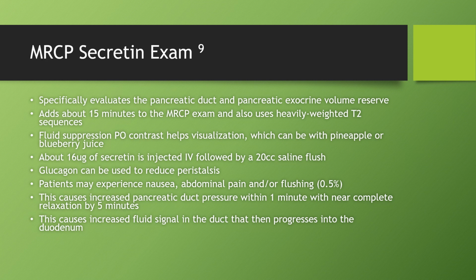So what this does is it specifically evaluates the pancreatic duct and the exocrine reserve. And so what happens is you do a regular MRCP exam, and then this will add about 15 minutes to your exam.